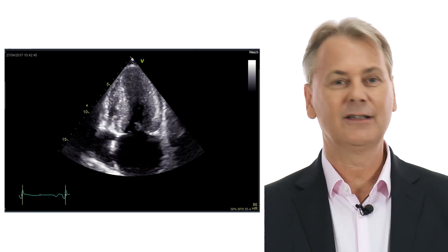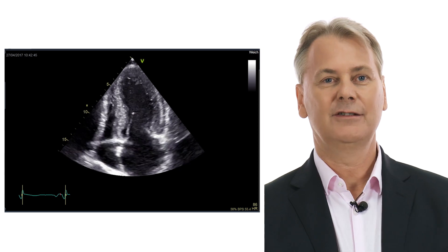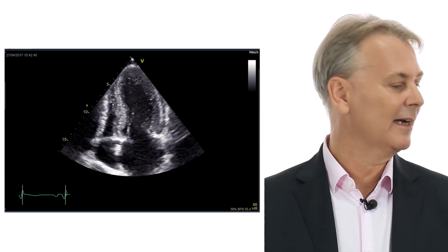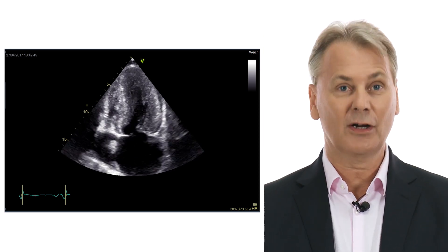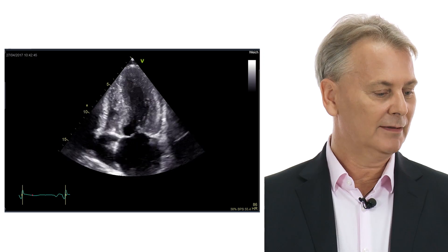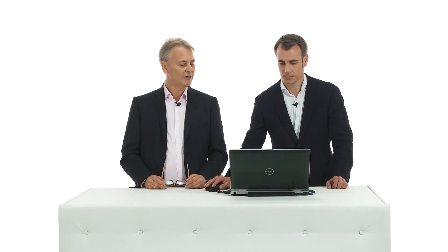So maybe we can go to the four-chamber view. In this case, the diagnosis is quite clear—this is hypertrophic obstructive cardiomyopathy. But what about ejection fraction? The ejection fraction is normal—if you would quantify it, it's highly normal. But we have to understand that normal ejection fraction does not mean that this heart is healthy.